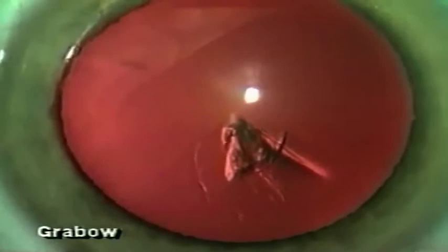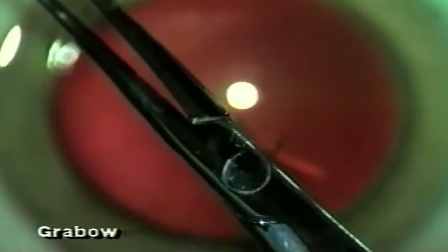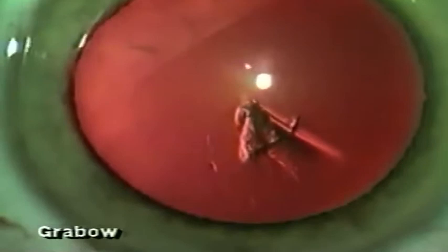The new capsulorexis forceps are hinged just proximal to the blades in the same plane as the blades, and they have a gentle curve over the anterior lens surface and have the Kirschner tips, which can be used to start the capsulorexis using the pinch technique.